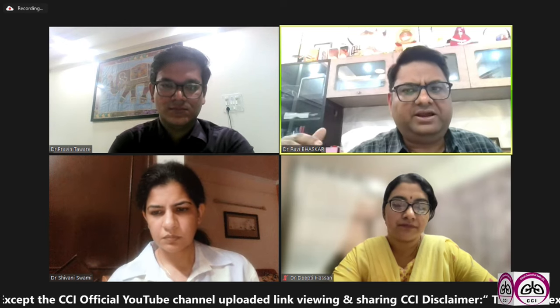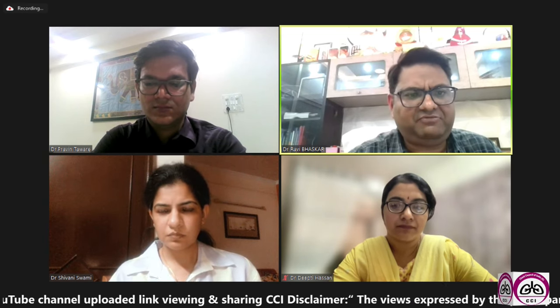So these are the few things which we can consider in kids. The best thing is if the child is less than 4, we can go for MDI with the spacer with face mask, and if the child is more than 4 and he can obey the orders and understand the things, then we can give him MDI with the spacer directly.